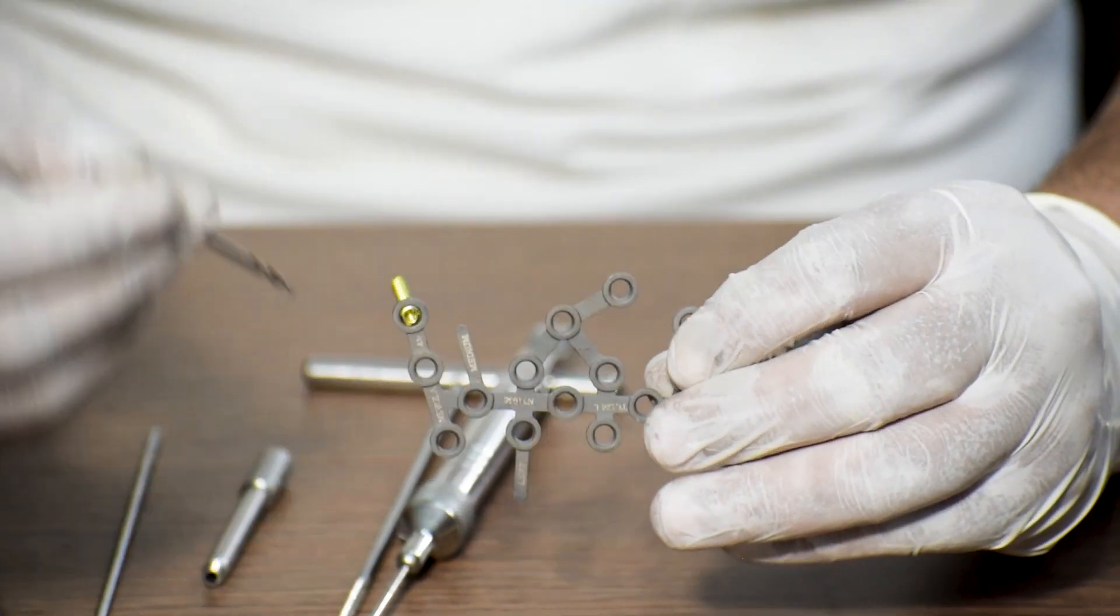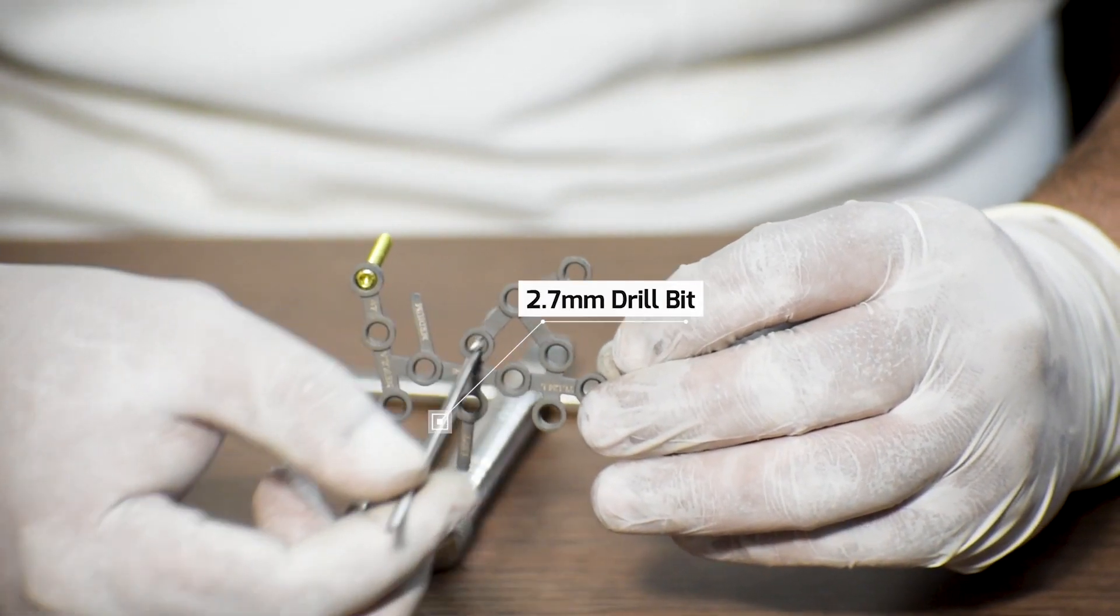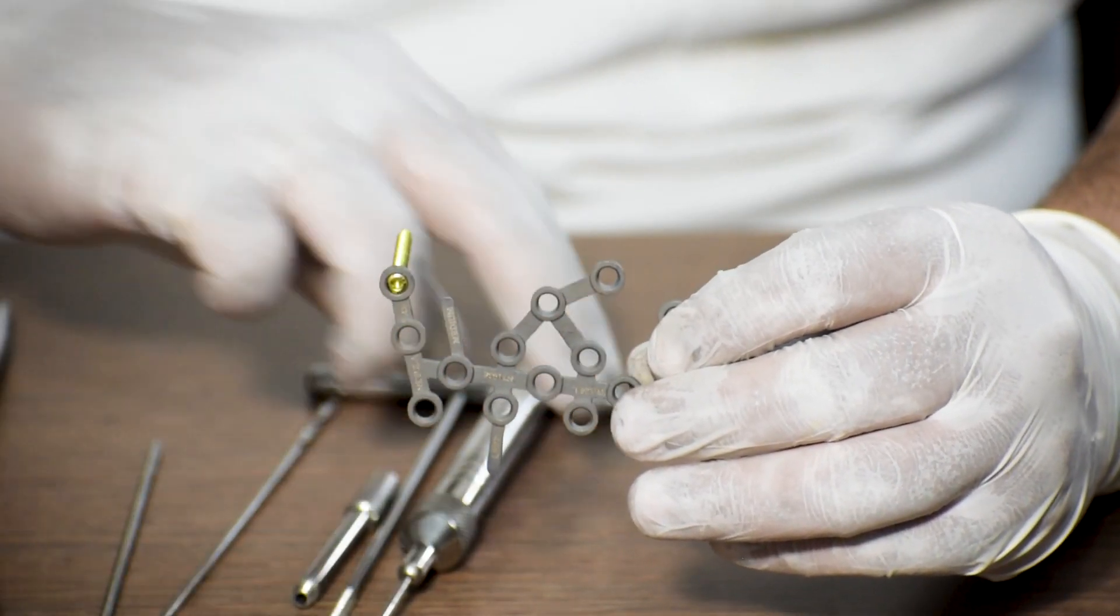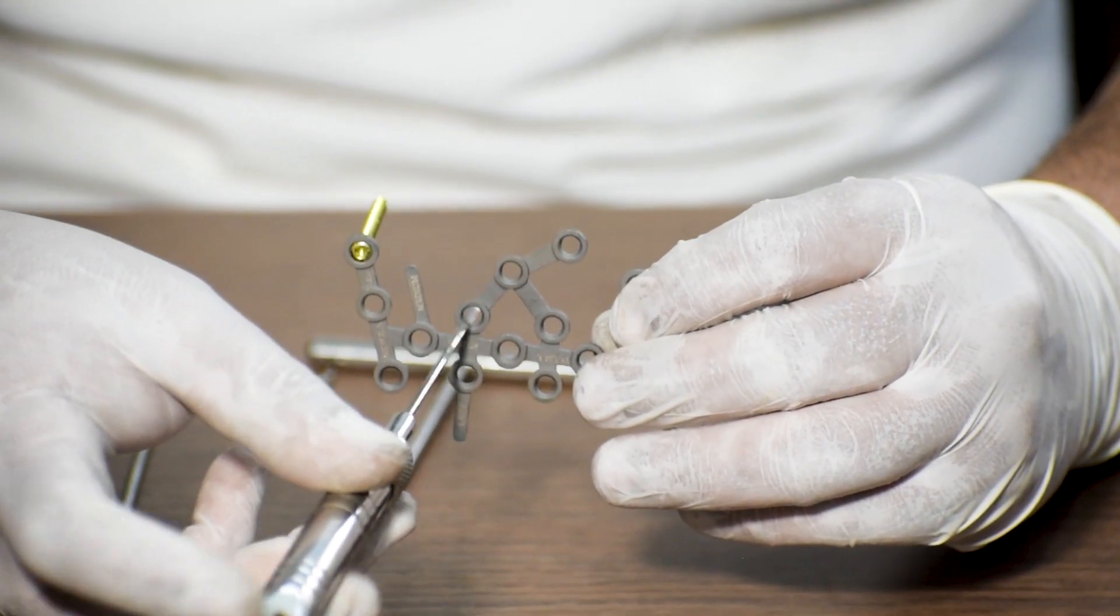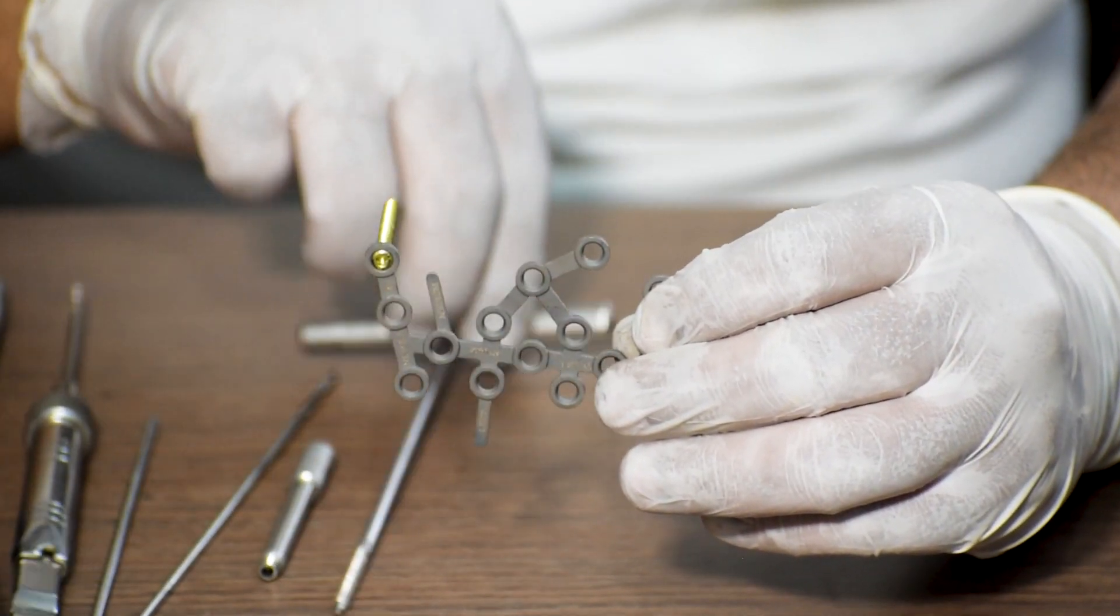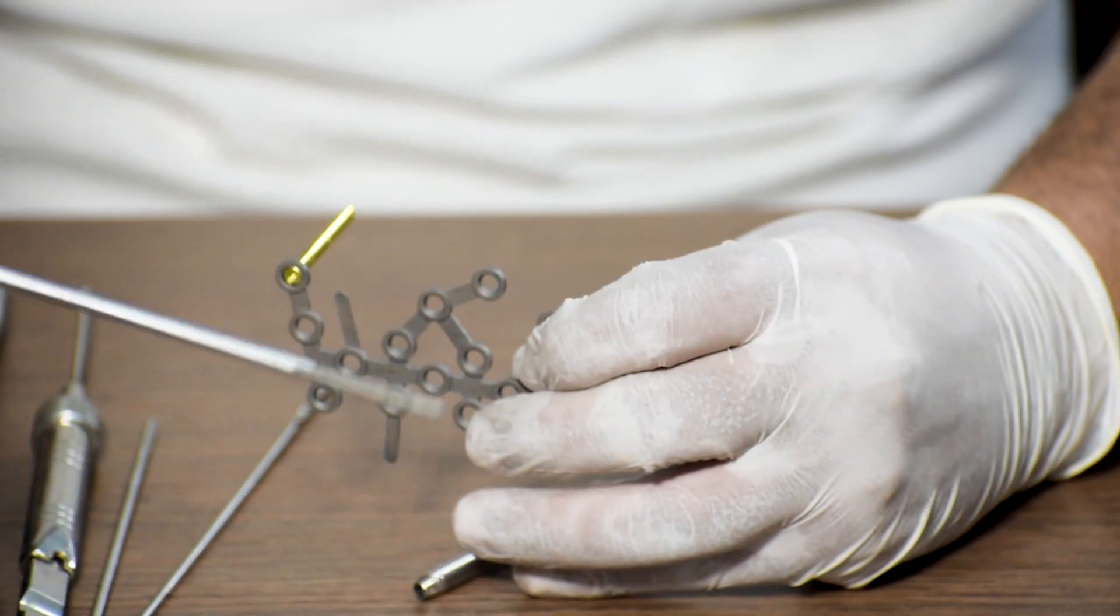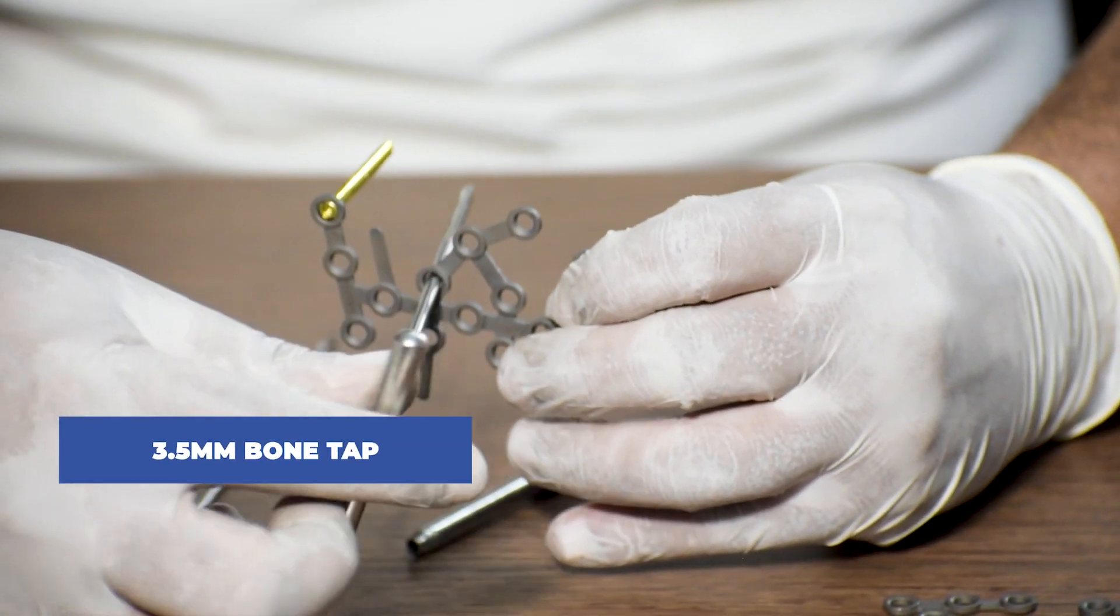If non-locking screws are needed to be fixed as well, we will take a 2.7 mm drill bit and drill through this hole. Again we use the depth gauge to measure the length of the screw needed to be fixed. After this, if required, we will use a 3.5 mm bone tap to make the entry of the screw smoother.